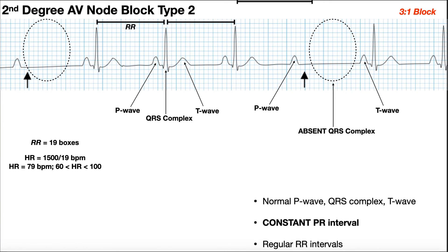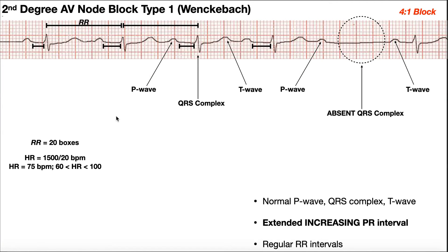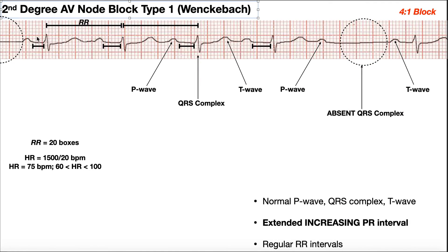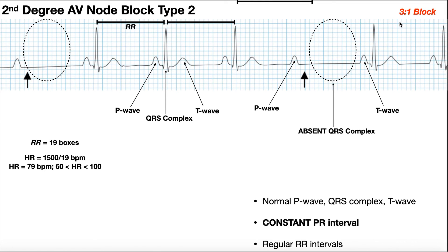We can also quantify second degree AV node blocks. This one is a 4-to-1 block — between the absent QRS complexes there are four complete QRS cycles. This other one is a 3-to-1 block, because we can clearly see two dropped QRS complexes and there are three QRSs between them. So we can quantify these second degree AV node blocks as well.